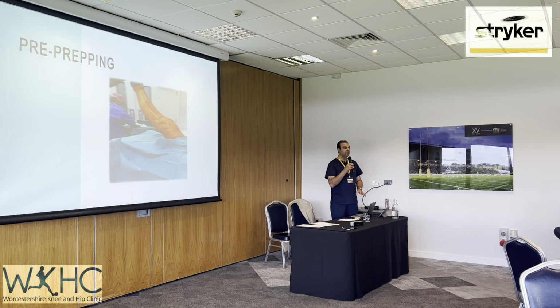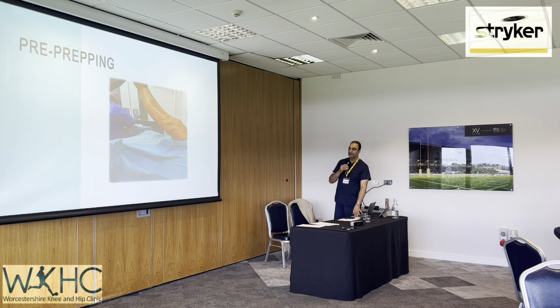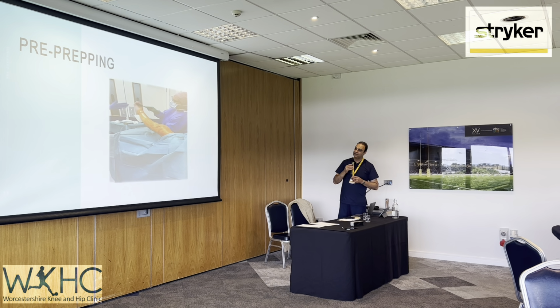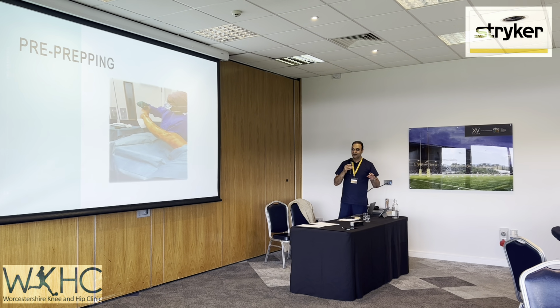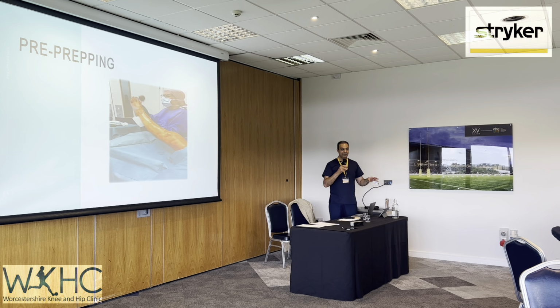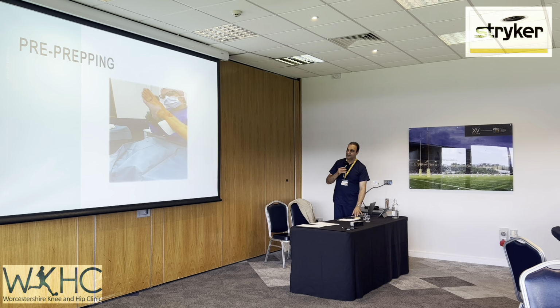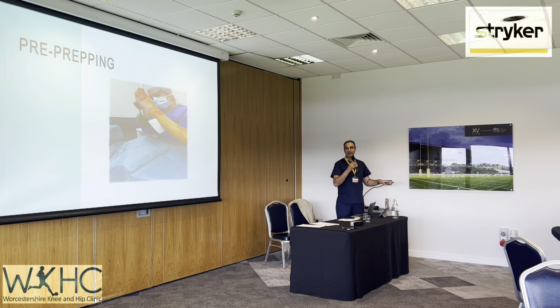We pre-prep, so we prep everybody. While the nurses are preparing the robot, we've got pre-prepping going on. There's one of our scrub staff, Louise, who's pre-prepping. So we prep very accurately. We do a proper full pre-prep in the anaesthetic room. So we take it seriously, they gown up, they do it properly, do the foot. So we reduce the risk of infection if we can. So this can be going on while you're setting up the robot.